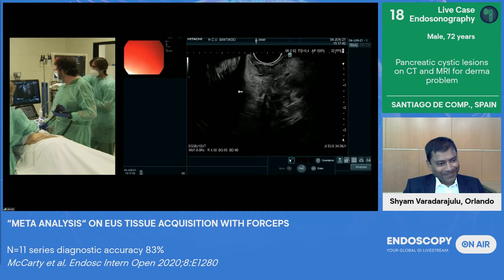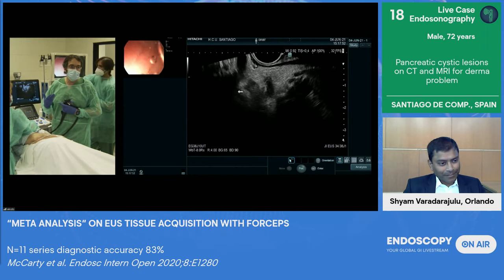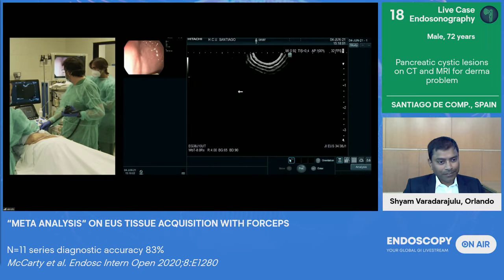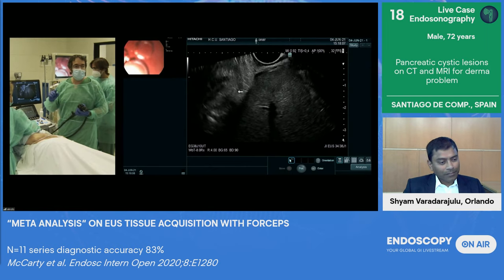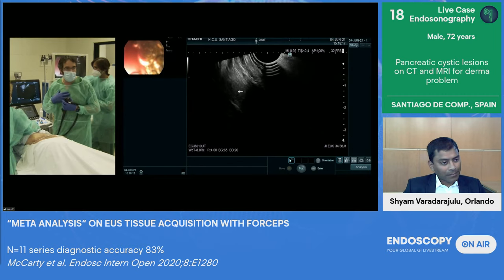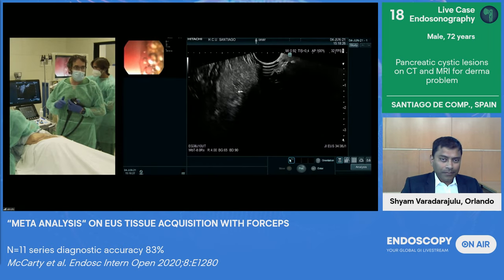Yeah. Whatever we are going to do, I think the best lesion to target is the big one. That is probably the one that is going to provide more information. And if we want to exclude dysplasia, you need to go to the bigger one because the probability of finding dysplasia is going to be higher in the bigger lesions. So before doing anything else, what I want to do and also want to show you is a contrast enhancement, because if there is something that we are missing in B mode, it can be enhanced with contrast enhancement. So I really expect, hopefully, that it's going to be an avascular lesion with no uptake, no enlargement of the wall, but the best technique to exclude any of these worrisome features, mural nodules, enlarged wall, is to do contrast enhancement.